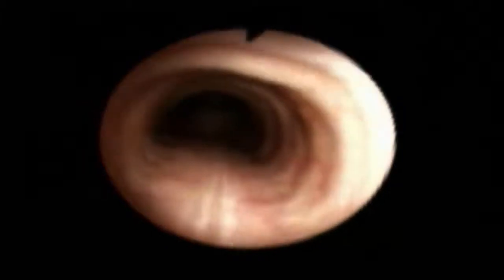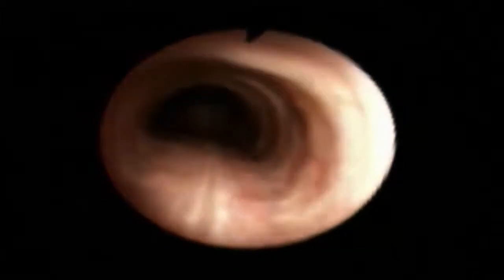Understanding the difference between the trachea with its rings and its posterior tracheal membrane and the esophagus is important because sometimes the scope is unintentionally advanced into the esophagus.